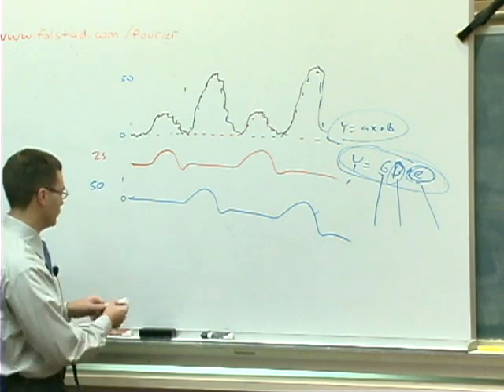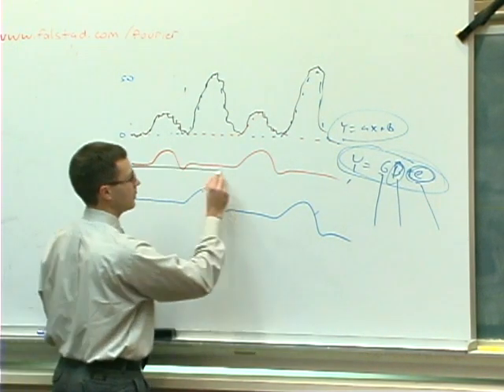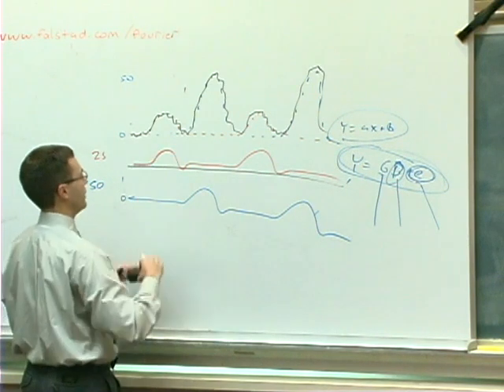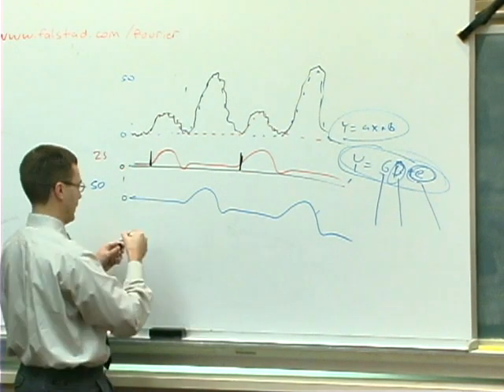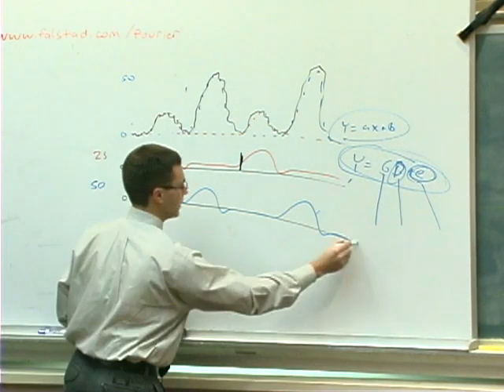Yeah, it's arbitrary. So you start off by saying, okay, I'm going to create a vector which is 0 everywhere, but it'll be 1 at the point in time where I presented a picture of a bagel. So I presented a picture of a bagel here, I presented a picture of a bagel here. So it's 0 everywhere, and then it's just 1 there. And then same thing here, this was 0 everywhere, and then 1 here.